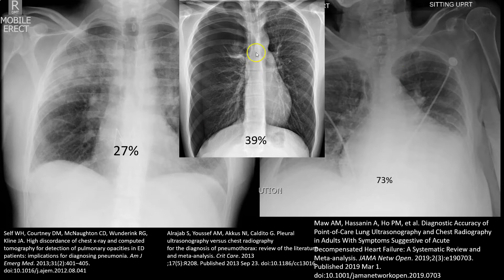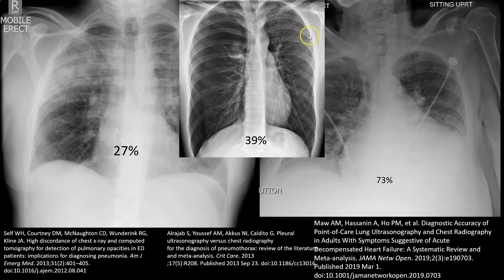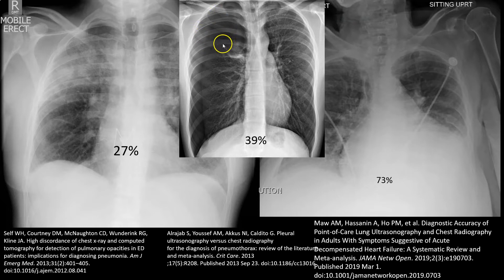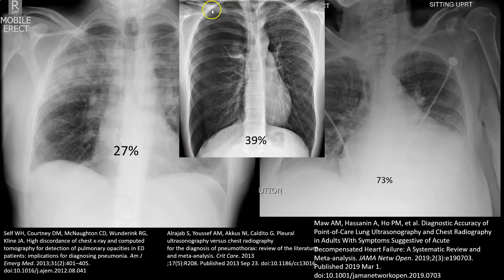We'll start by looking for a pneumothorax. On this chest X-ray, you can see the clavicles and the ribs. On the normal side, you'd expect to see the lung margin extending all the way out, with small white patchy spots representing lung parenchyma filling the whole space. On the other side, the lung parenchyma is not extending out — there's air within the pleura causing the visceral and parietal pleura to separate and the lung to collapse. This is a pneumothorax, and you can see the heart starting to shift over.